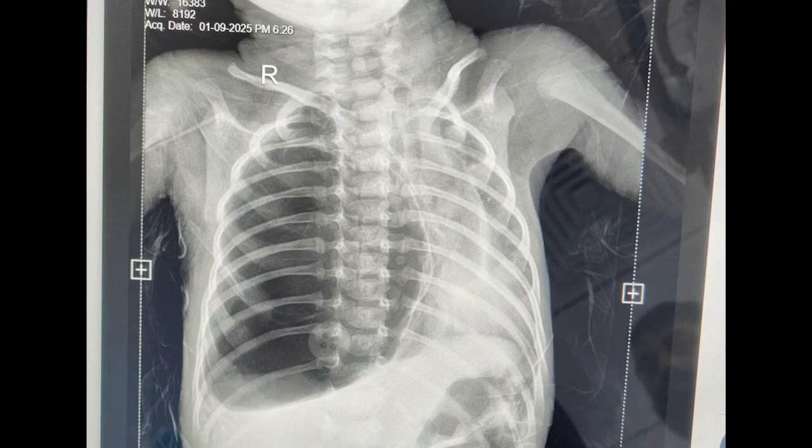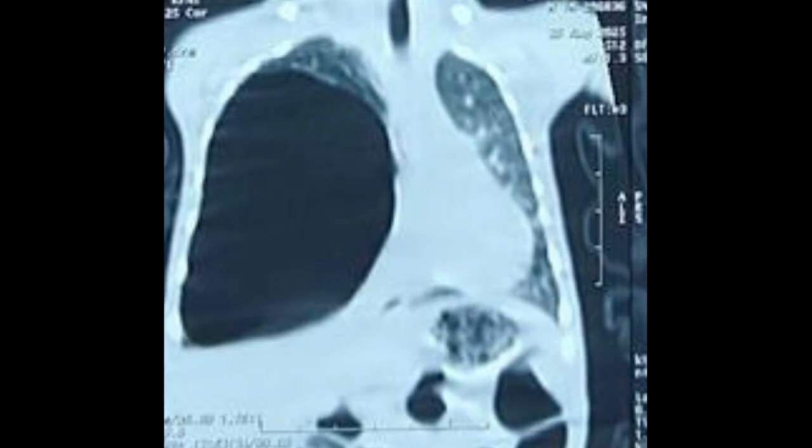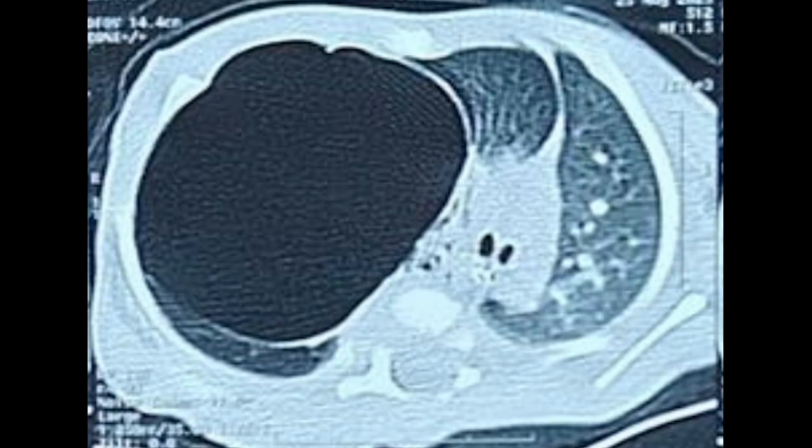So this is the preoperative x-ray in which we can see a huge lesion on the right side which is compressing the right lung and also causing a mediastinal deviation and compression of the left lung. These are the CT images showing the same finding. So the patient was stabilized and taken up for surgery.